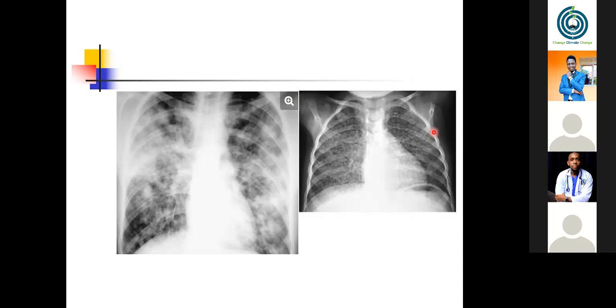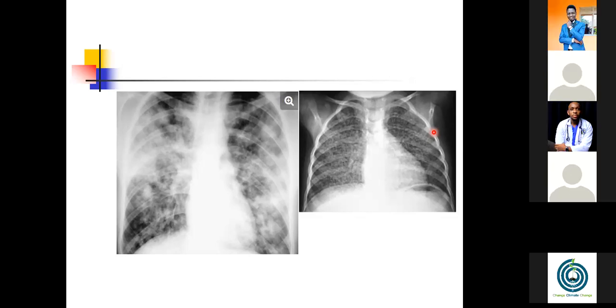So my question is about CT of the chest. Is there a role of contrast when you're trying to differentiate the different pathologies? Yes. Contrast plays a big role when we are differentiating those many structures, because naturally some structures don't have very good contrast from the other neighboring structures.